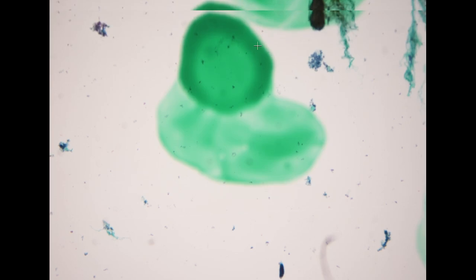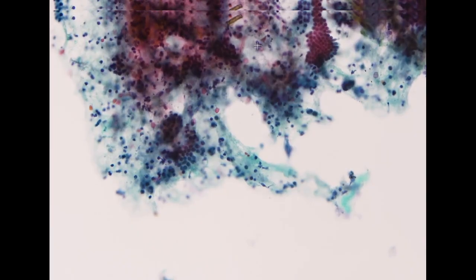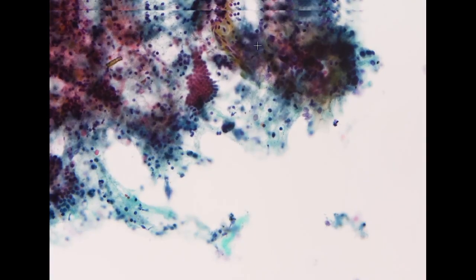So the next case is an EUS guided aspiration specimen. These are also coming from the pancreatobiliary tract, so the morphology would be quite similar. In this cytology specimen, we identify prominent necrotic and degenerative changes, which make it a little bit difficult to interpret.